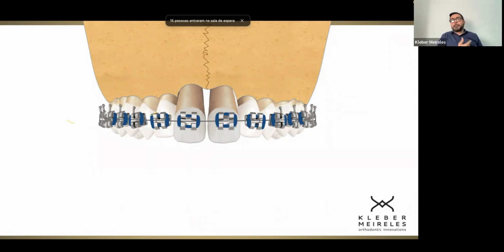First of all, you need to apply the force at a specific activation per time. In this case, 0.5 millimeter each 15 days. I can do that using step by step, not applying just the higher position of the bracket. Sometimes I can do that, like at the end of our treatment or the end of our movement, just for facilitating the process.